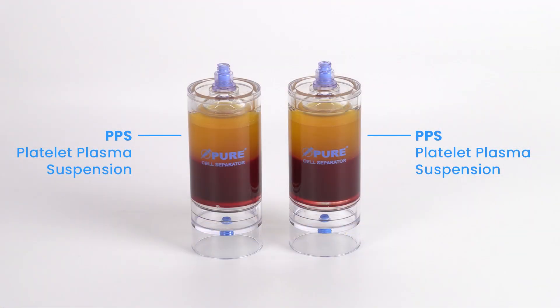After centrifugation, the platelet plasma suspension, or PPS, will be separated above the red blood cell layer.